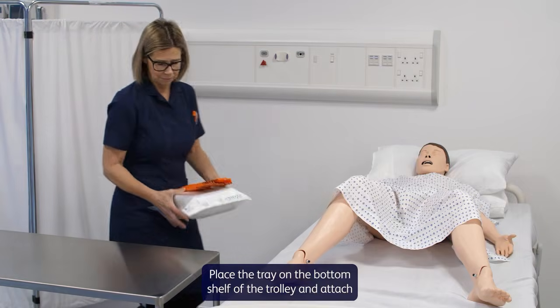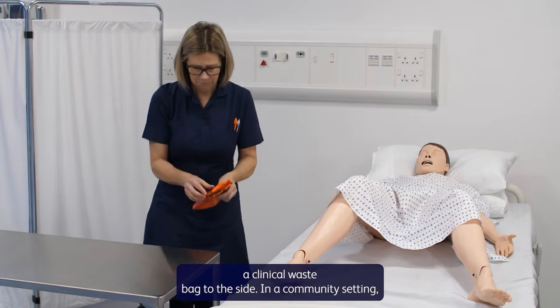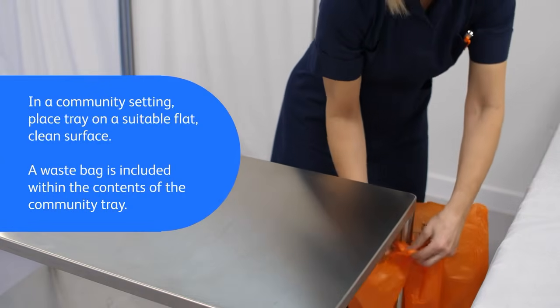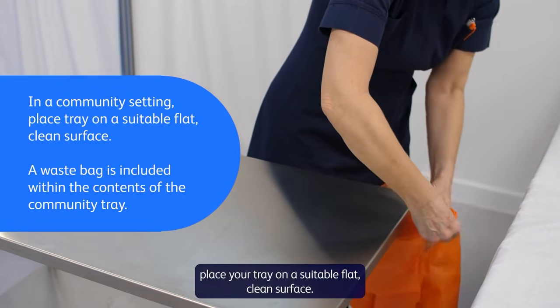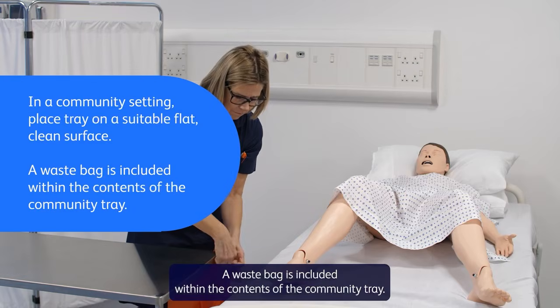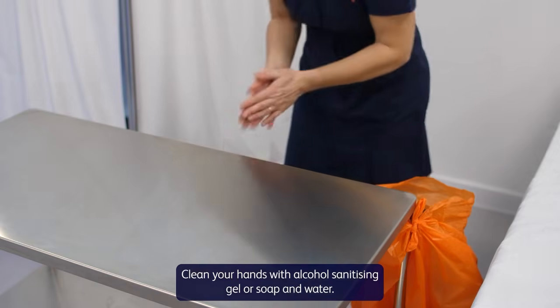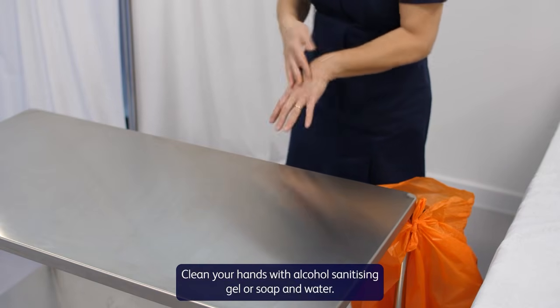Place the tray on the bottom shelf of the trolley and attach a clinical waste bag to the side. In a community setting, place your tray on a suitable flat, clean surface. A waste bag is included within the contents of the community tray. Clean your hands with alcohol sanitizing gel or soap and water.